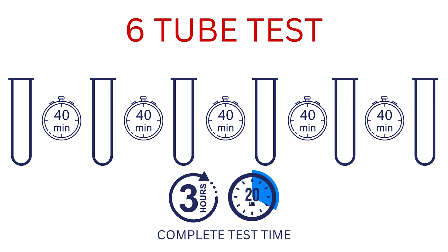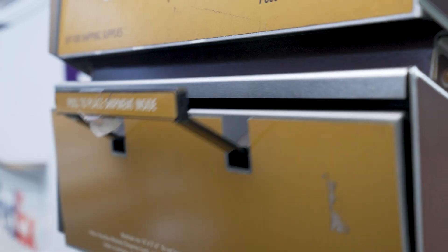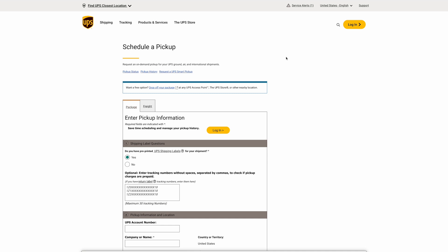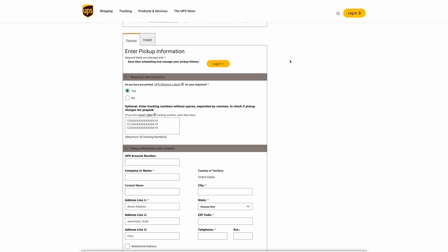Once all samples are collected, pack the test tubes back into the kit, seal it with the provided label, and send it back to our lab. Samples must be received within two weeks of collection. You can return your kit via any UPS location, driver, or even schedule a pickup at ups.com.